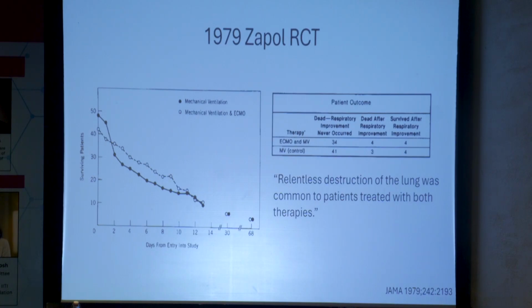That put a big damper on the popularity of ECMO around the country and around the world, because this trial, funded by the NIH in the U.S., done in Boston, Bartlett involved, really did not show a clear clinical benefit. Fortunately for ECMO, and I'm not going to go into it in detail, around the same time in the mid-70s, there were positive trials in neonatal respiratory failure, which basically allowed the technology to continue to become available and to continue to be studied in primarily pediatric populations, but selectively in adult populations as well.